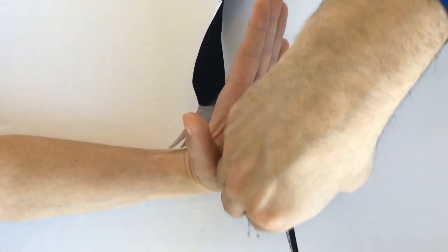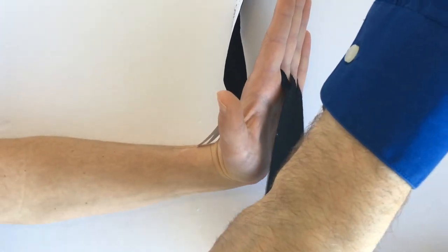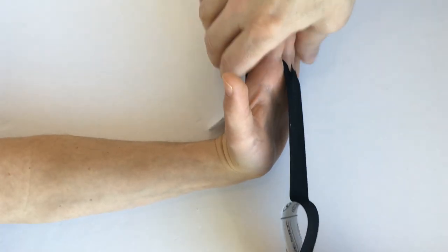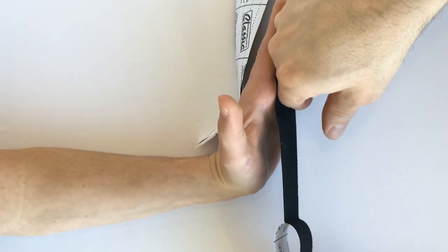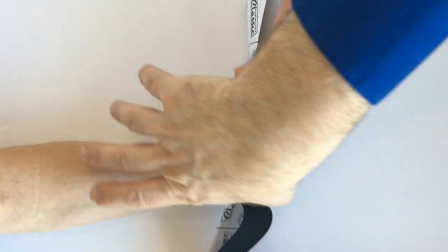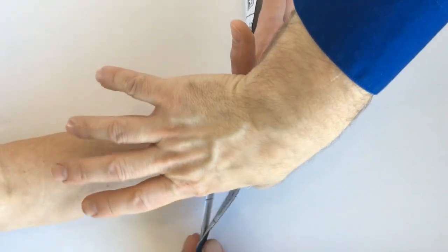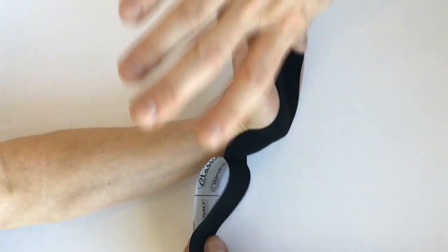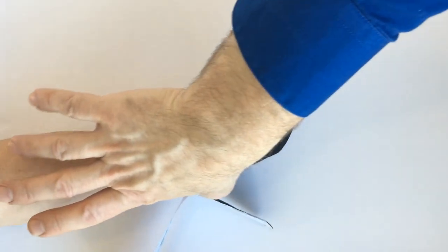Then what you want to do for edema with kinesio tape is put the tape on with really no stretch—maybe just a tiny bit of stretch, but I prefer no stretch—and actually stretch the skin away from the tape as you can see here as I'm applying it.